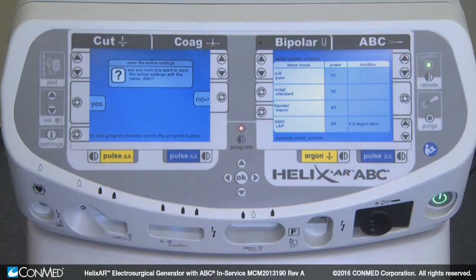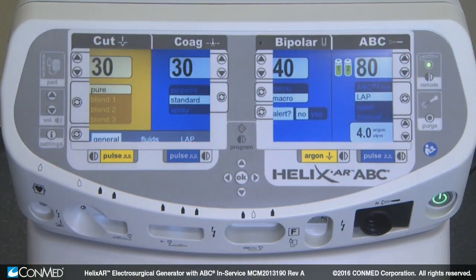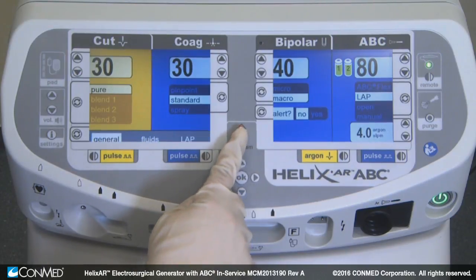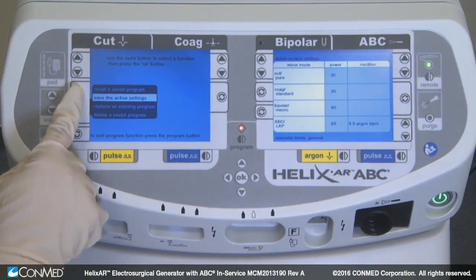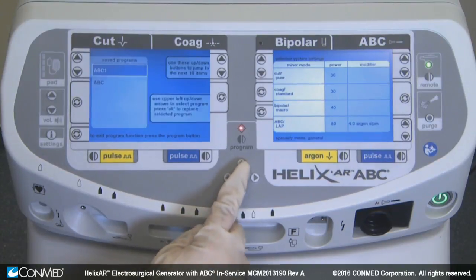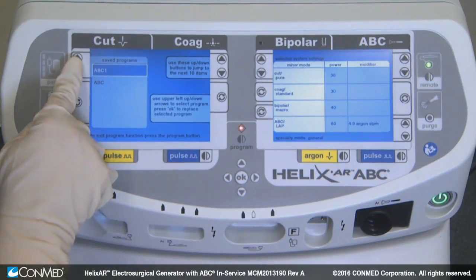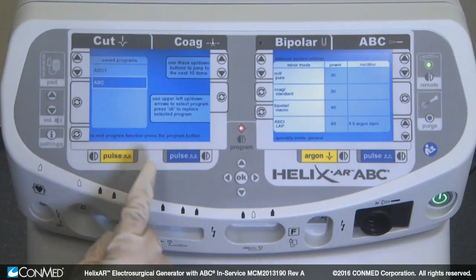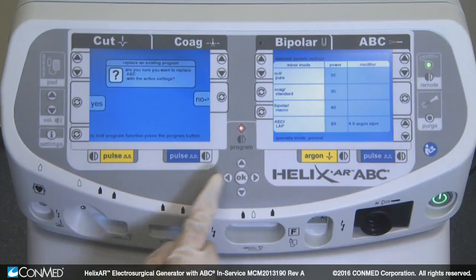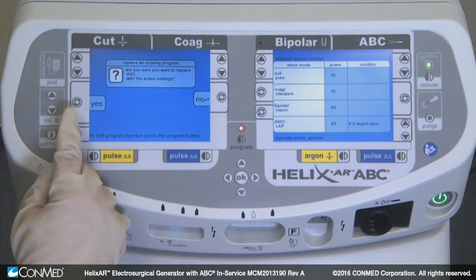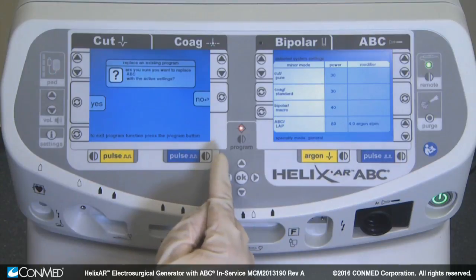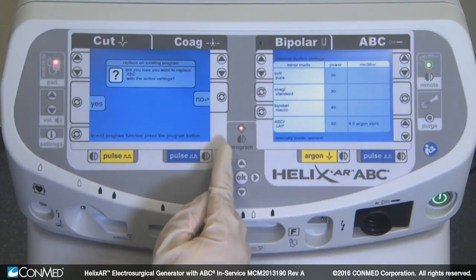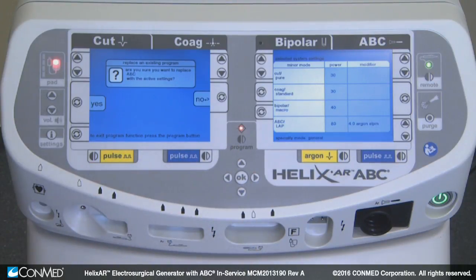To replace an already existing program with your current settings, push the program button and select Replace an existing program. Press OK. Use the arrow keys to select the program you would like to replace, and press the OK button. Choose Yes to confirm, or No to return to the previous screen. Press the program button to exit program mode without making changes.